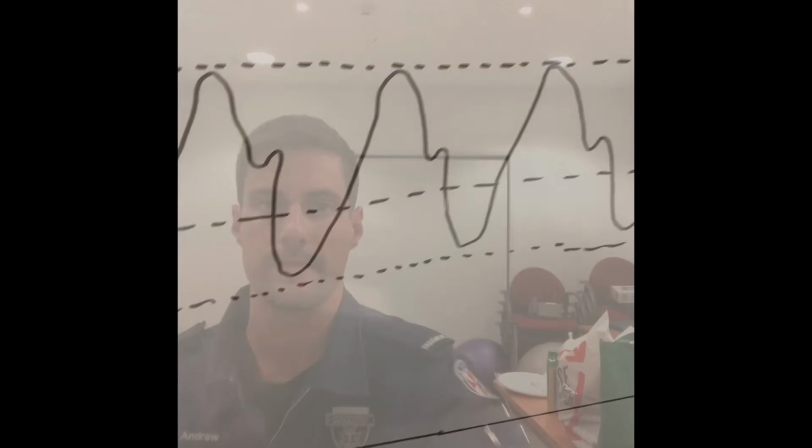Now, some basic principles of safe transport with the arterial line: if it does become dislodged at some time, which God, I hope it doesn't, apply direct pressure and elevate, as this will be an arterial bleed, the cannula has been in an artery. Ensure that the line is not tangled, it is clear and non-obstructed. Do not interfere with the circuit, just don't touch it unless you need to.